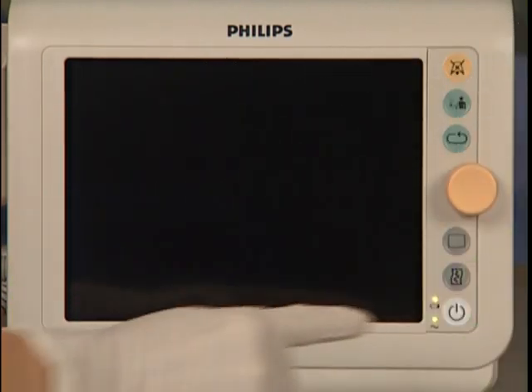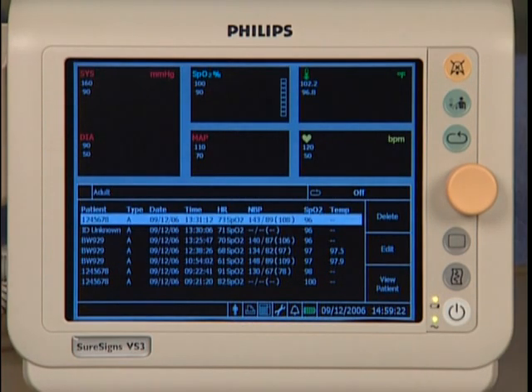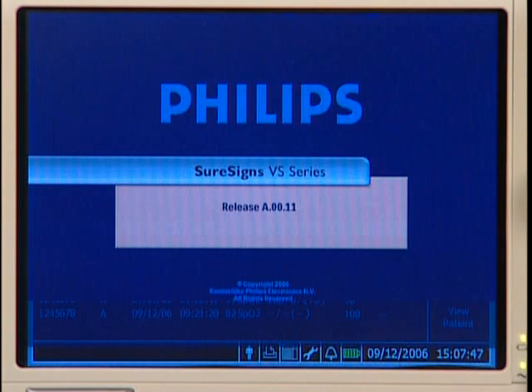Press the on/standby button and the VS3 powers up. When the monitor is on and has not been used for a defined time period — 5, 10, 15, or 30 minutes — it enters auto-suspend mode.